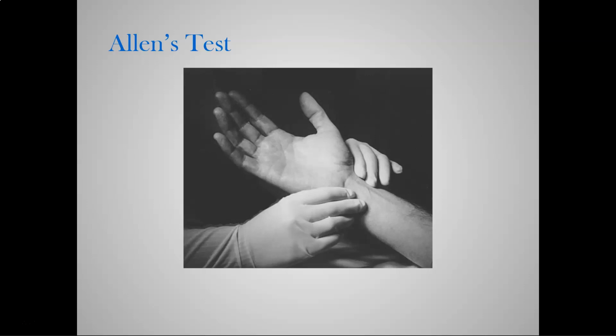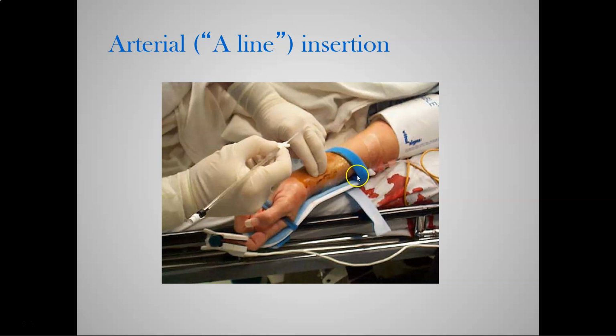There are instances where you have sclerotic buildup, calcified arteries, and you cannot get accurate readings at the radial site. In that case, you'd have to go to the femoral site and use that, okay, or a different location in general, maybe even the other arm. So just be aware of that.